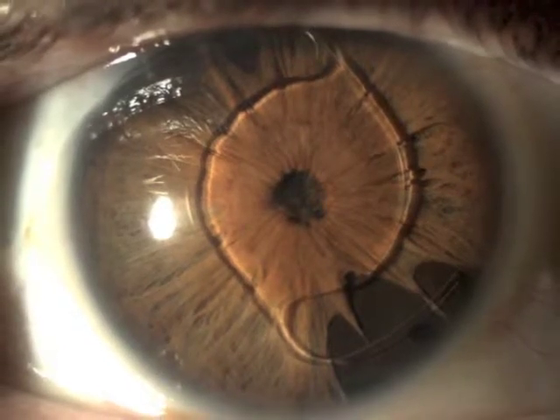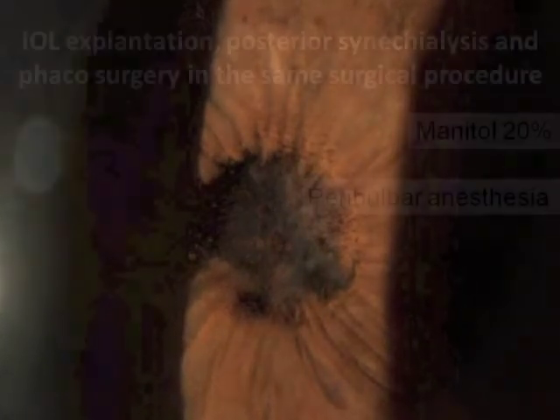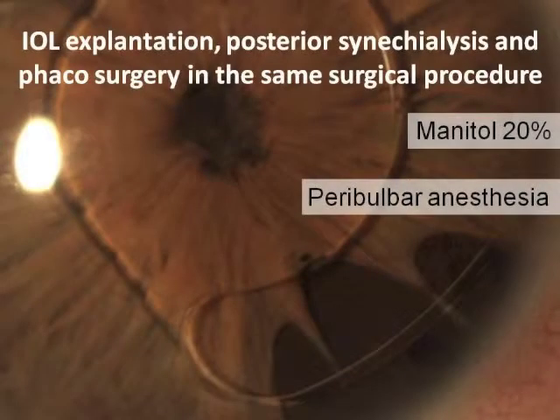We are going to present a high myopic patient with anterior chamber phakic IOL, 360 degrees pupillary synechia, both haptics trapped in the angle, and iris atrophy. We performed IOL explantation, posterior synechialysis, and Phaco surgery in the same surgical procedure.